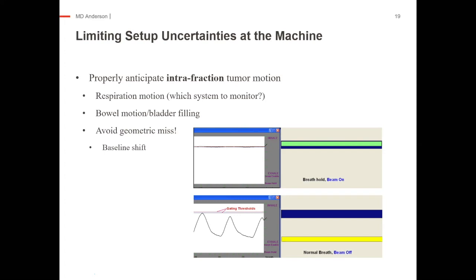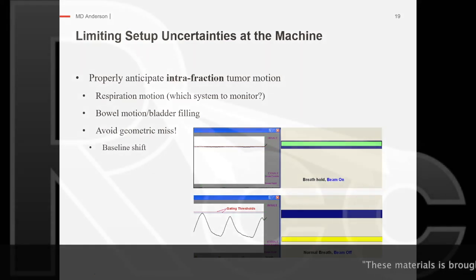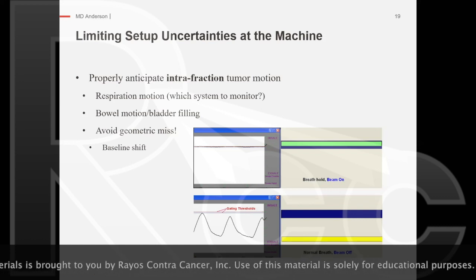Is there anything else you tell them about apart from the gating and the compressor and compression? I mean, we typically just walk them through everything like you would any other patient, right? You are setting them up, you want to make sure they're comfortable, tell them they're going to be lying in that position for a long time, walk them through the whole breath hold, and it's important to breathe consistently so we can get a good CT for the 4D. We try to just explain everything as we're doing it, tell them on the machine, tell them when we're doing imaging, tell them when we're about to start treating, just try to keep that communication open. But in terms of the education, I think the breathing is important. Also, if they're going to be NPO or something, then educating them about that as well.